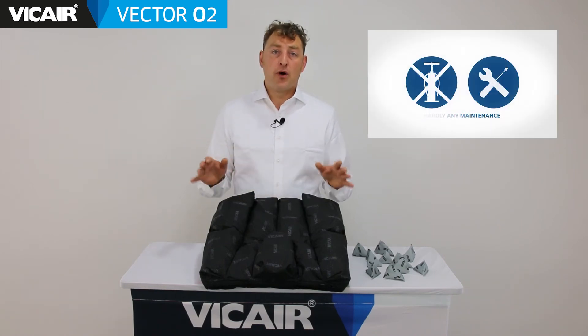The Vicair Vector O2 is easy to use. There is no pump or additional equipment needed to use the cushion. Furthermore it is machine washable in its entirety. Smart cells stay in their compartments so your setup is maintained. The cushion is safe to use due to the hundreds of smart cells inside. Even in the unlikely event that a cell fails, you're still protected.